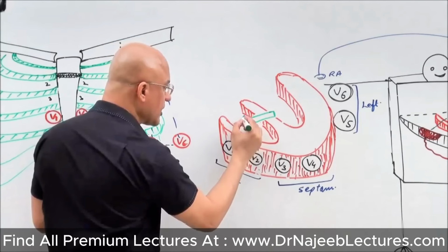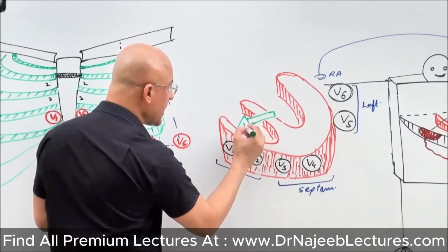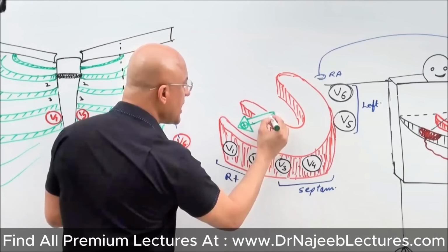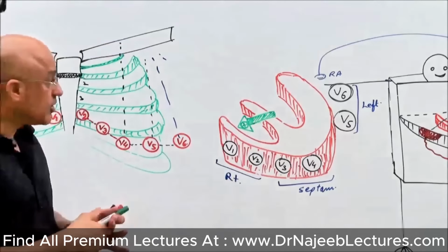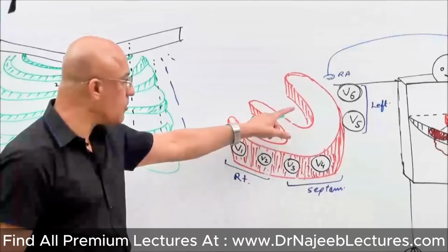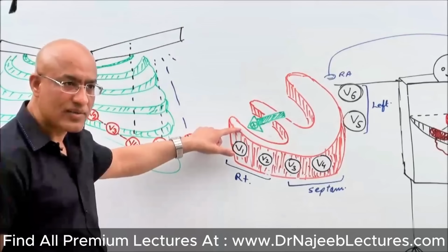In my early lecture, if you don't know this, refer to my earliest lecture on basics of ECG, that the interventricular septum undergoes depolarization from left to right.